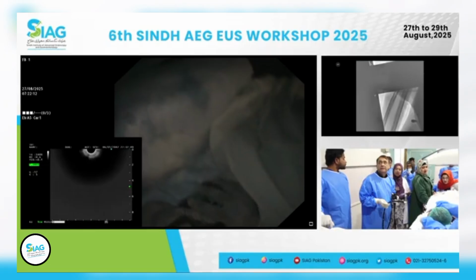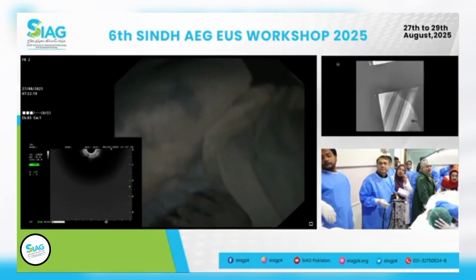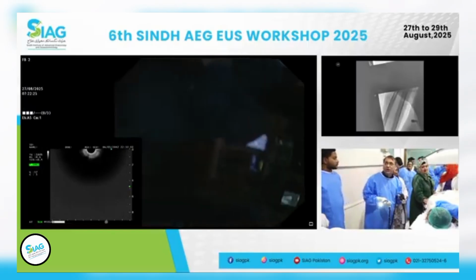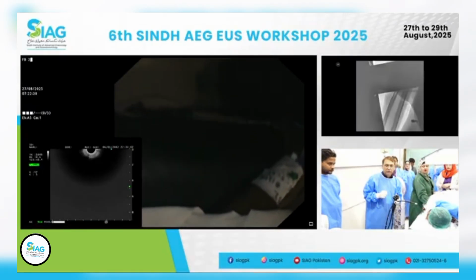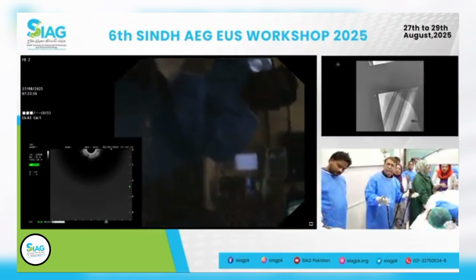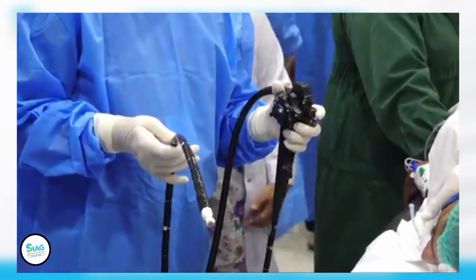Okay. Are we audible? Saad bhai, can you hear us? Khalid, do I have a choice? No, not today. Assalamu alaikum. We'll go ahead and present the case. We can see you and we can see the film. Okay. And that image of hands, is it big enough for everybody to see the movements? Yeah. Okay. I think it's very clear. It's perfect now.